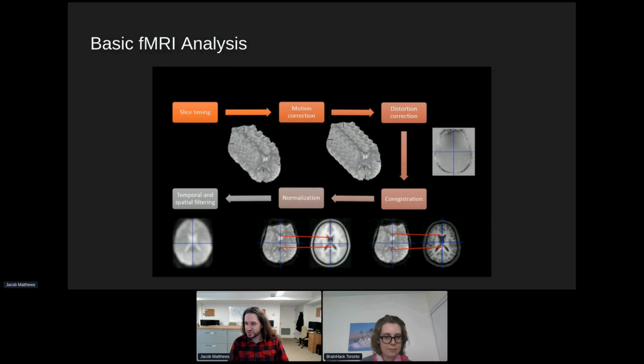And then there's calibrated and quantitative imaging in some other domains like ASL, where again, instead of just comparing, oh, the blood flow is higher in this region or higher in this subject for this particular study, you can instead calibrate those, get specific: the blood flow was measured at this value in these units. Then you can more easily compare that to literature values from other domains or across sites and different types of scanners where your weighted values might be different.